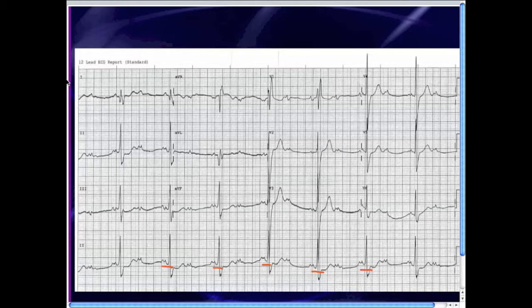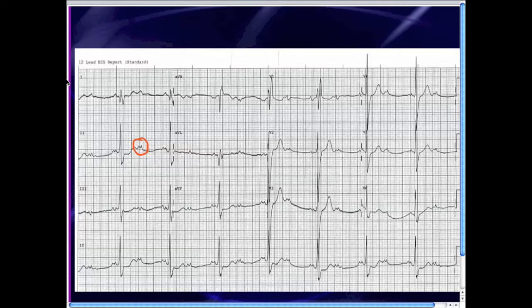So the rhythm is sinus rhythm, second degree AV block with two-to-one conduction. A couple of other things you notice: these P waves are of bizarre morphology — they are double peaked, or bifid, a wide P wave. The bifid, wide P wave in lead two implies left atrial enlargement, and that is usually associated with mitral stenosis. So left atrial enlargement with probable mitral stenosis is present.